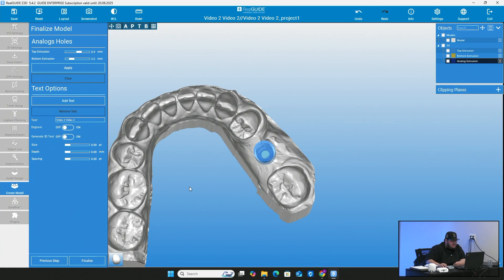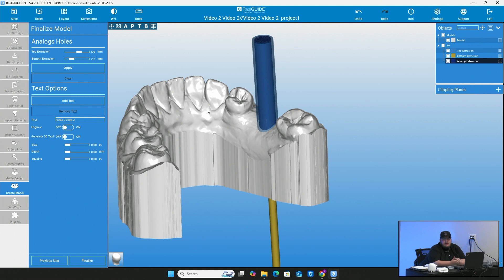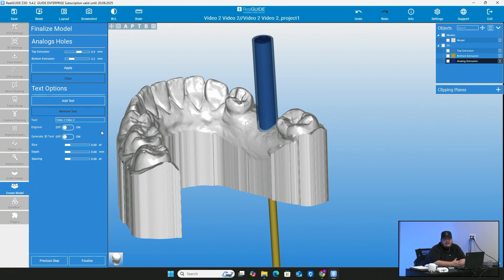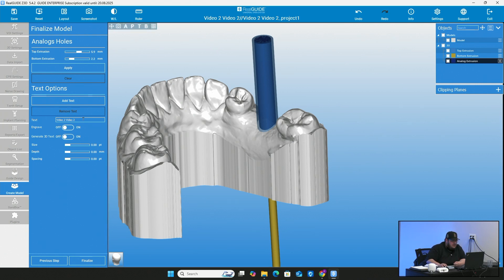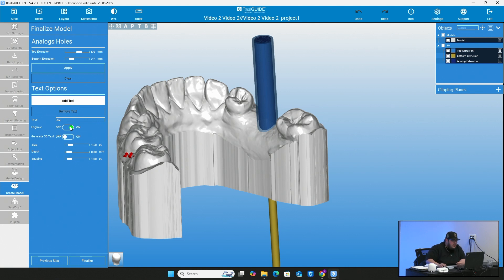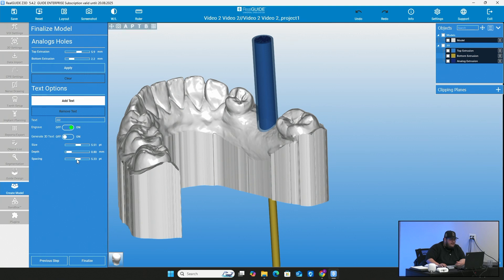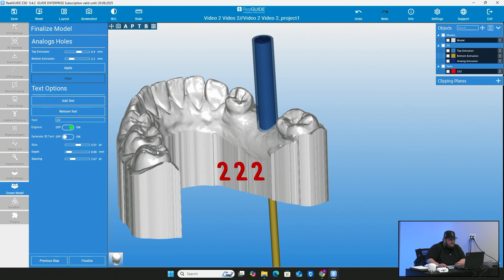And then of course, text options. So if you're printing this out in your laboratory or in your practice and you have multiple cases that maybe you're doing at once and you want to be able to differentiate which goes where, you can obviously go ahead and add the patient's name. We have pan numbers that helps us differentiate where things go. So for example, if I have here and let's say the number is 222, I can go ahead and add the text and I can go ahead and hover over where I want to put it. I can also have it engraved or not. So I can have the numbers sticking out or engraved in the model. And then I can also generate the 3D text. You can also change the size, the depth and the spacing of it.